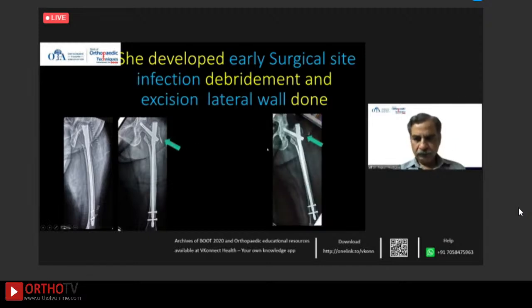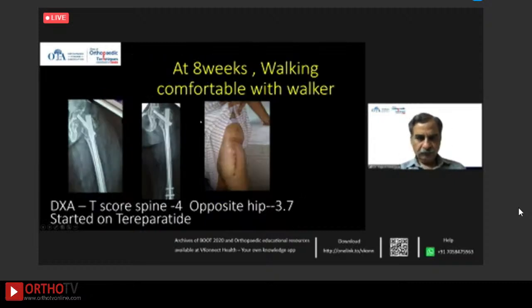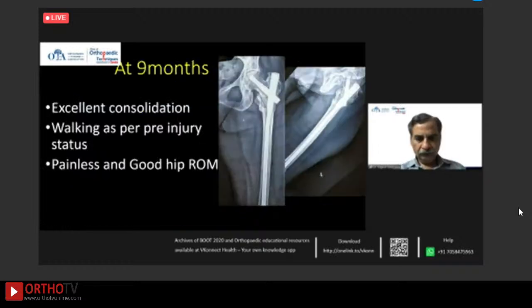Unfortunately, she had an early post-op infection. So on the 10th day, I explored, debrided the muscle and the lateral wall. Also, there was some infection underneath the lateral wall, so I excised the lateral wall. What saved me and saved the patient was the anterior medial stability, which was afforded by the mobilized lesser trochanter. Here you can see at 8 weeks, walking very comfortably. We had to start her on teriparatide because her DEXA was very poor. And this is at 9 months.